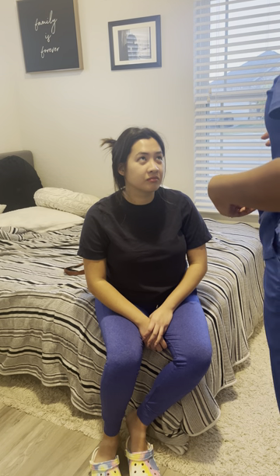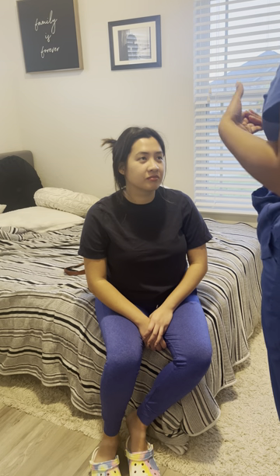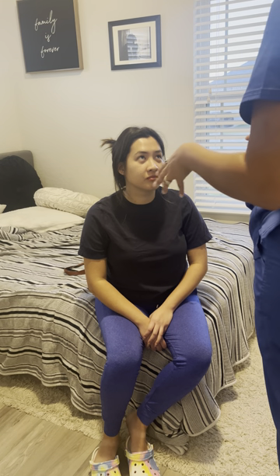So first I'm going to provide privacy for you. I'm going to wash my hands, I'm going to gather any equipment I might need, which in this case is a pen light. It would also be a tongue depressor and gloves — I don't have that on me at this moment, but you would need them in a regular situation. I already explained the procedure to you, don gloves if indicated, and I'm going to position you correctly, which the way you are right now is perfectly fine.